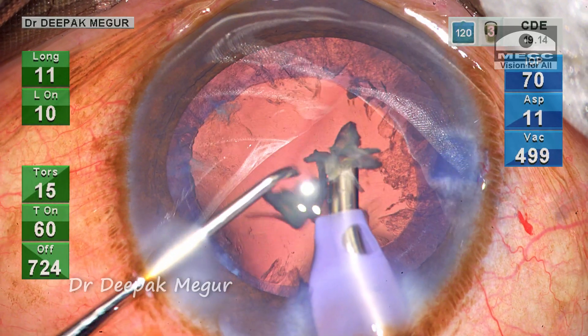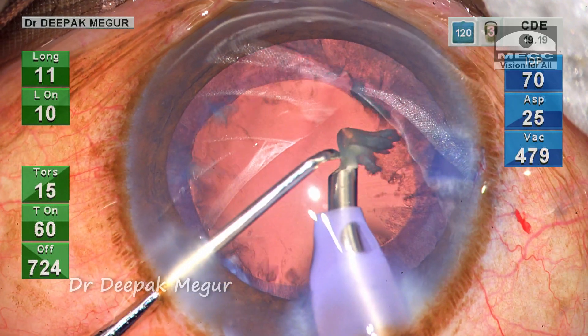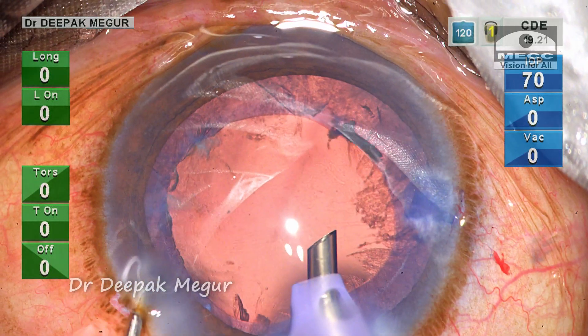I anticipated this issue because of the pre-existing loose zonules. The irrigation fluid would have traversed across the zonules into the Berger's space, and this misdirected fluid is pushing the posterior capsule anteriorly. However, I could manage to remove all the fragments successfully without damaging the posterior capsule.